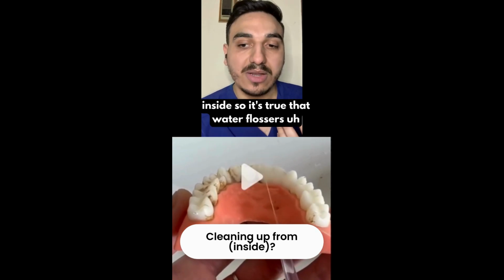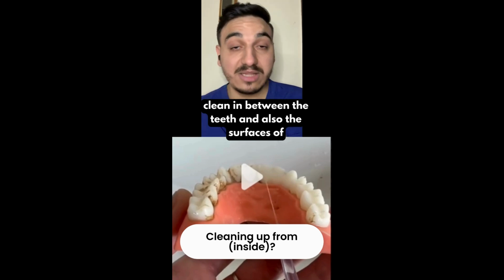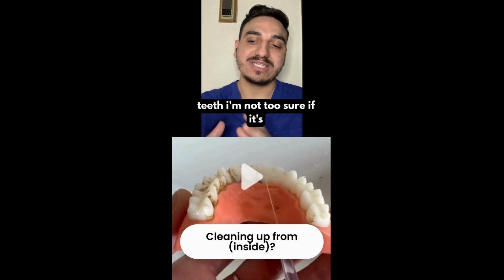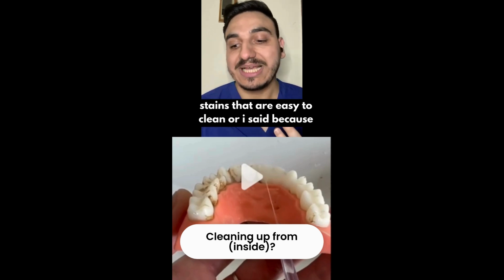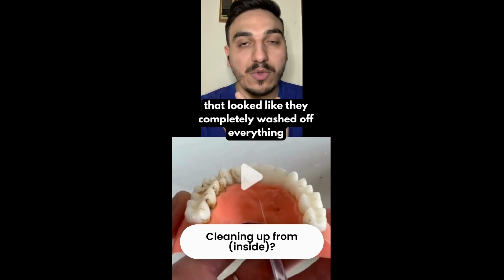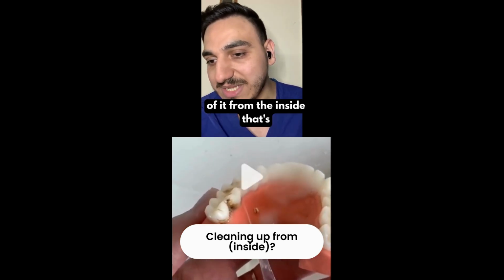So it's true that water flossers help to clean in between the teeth and also the surfaces of teeth. I'm not too sure if it's that much powerful. It looks like they had some either really superficial stains that are easy to clean, or I'm not sure, because that looked like they completely washed off everything. That's not necessarily how it works. Oh, look at it from the inside.